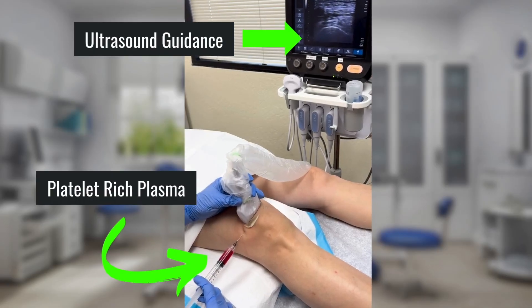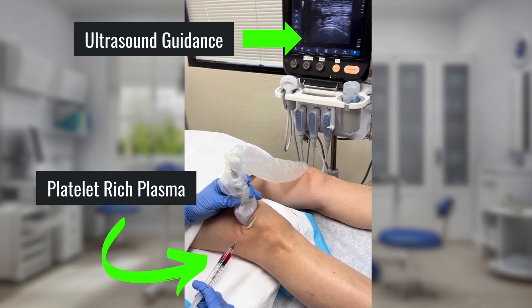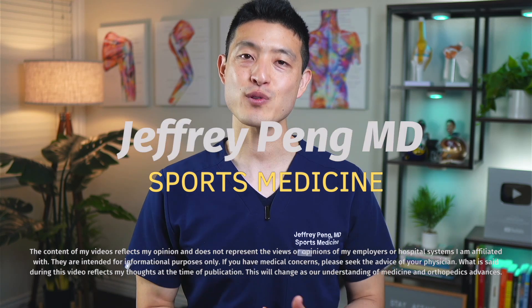I'm going to show you an actual ultrasound-guided platelet-rich plasma injection that I performed for a patient with knee osteoarthritis. Hey everyone, Dr. Jeff Pang here. I'm a sports medicine doctor and I've performed countless PRP injections to help patients find relief from knee osteoarthritis. In this video, I'm going to show you how easy the injection process is and what the PRP preparation looks like.